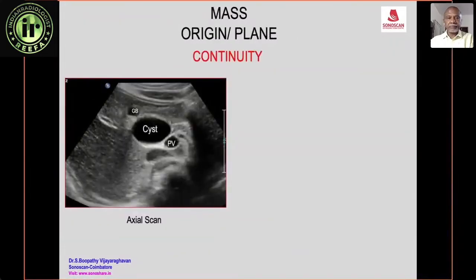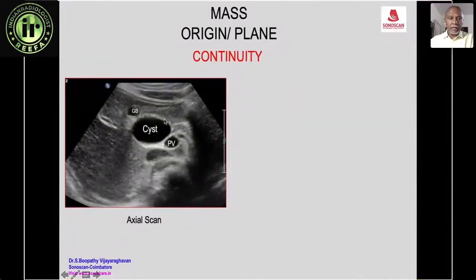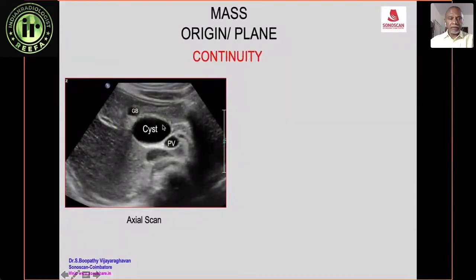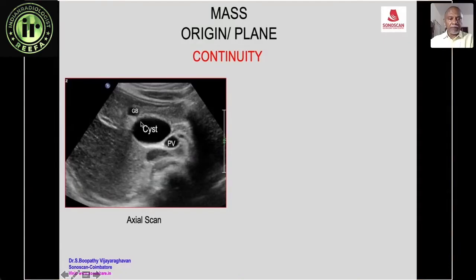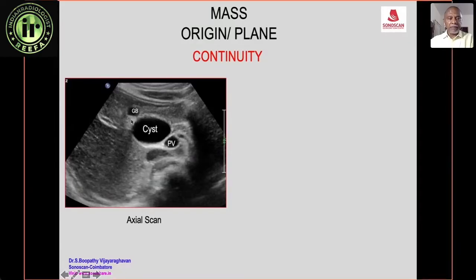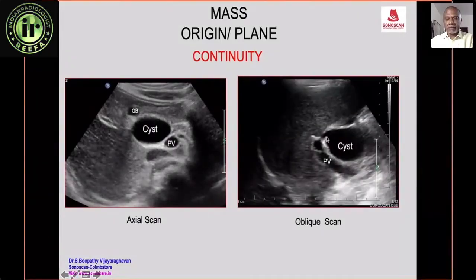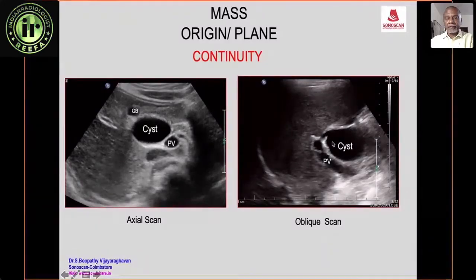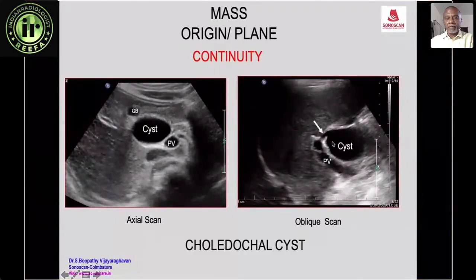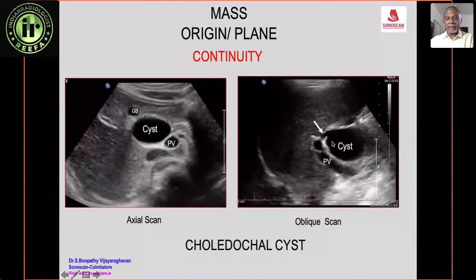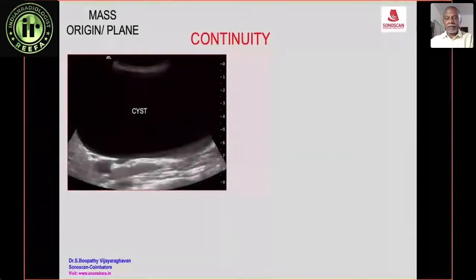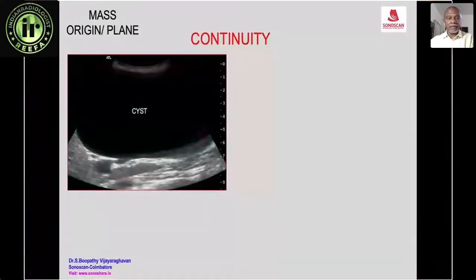The sign of continuity: on a transverse scan of the pancreas and portal vein, a cyst is seen anterior to the portal vein. The cyst is continuous with the common hepatic duct, confirming the diagnosis of a choledochal cyst. Continuity confirms the diagnosis.